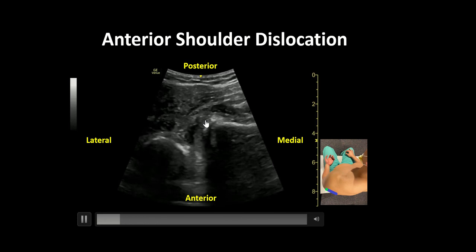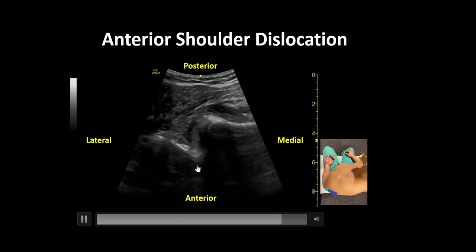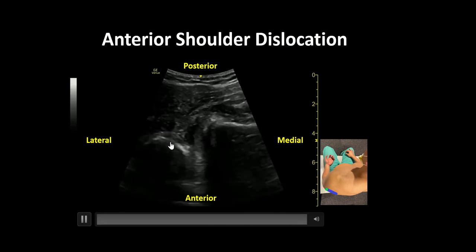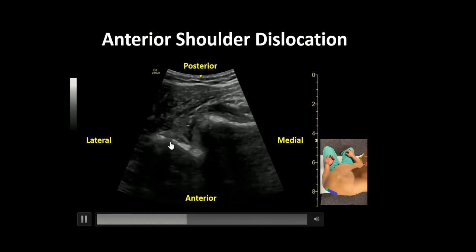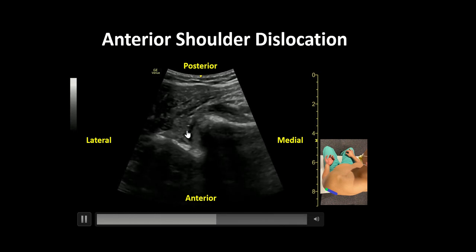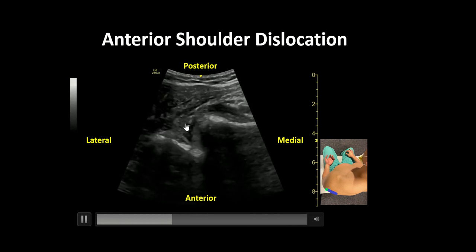The glenoid is seen here as a hyperechoic line with the rounded humeral head displaced anteriorly in the far field. In between, we see heterogeneous material that is likely blood in the setting of acute trauma.